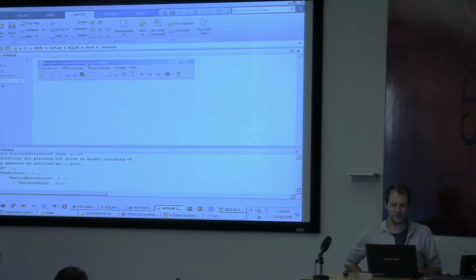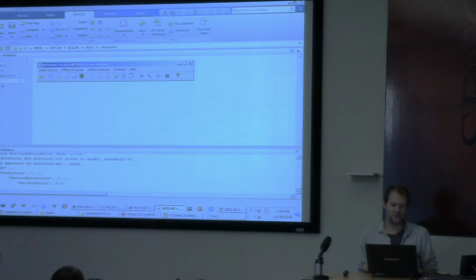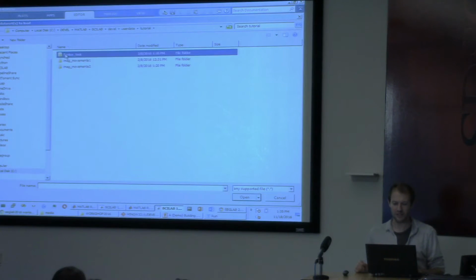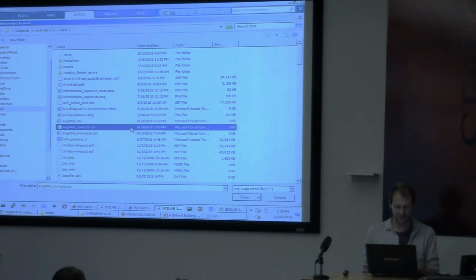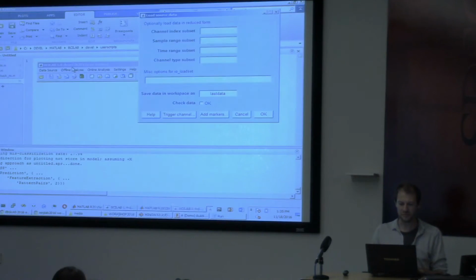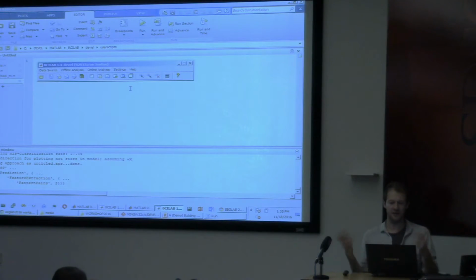Now the next thing is, well, this method turns out to be machine learning powered. So it doesn't just run out of the box. You have to first have some calibration data, which is almost always the case in brain-computer interfacing. So you need to adapt to the person's specific brain patterns, usually, and so you load some calibration recording, which you hopefully have already recorded. That is very much like a psychological experiment where you present different kinds of examples of cognitive states, say left-hand movement, right-hand movement, imagination. So I'm loading some data set here, emag.set. That's a person imagining repeatedly left, right, and so on.